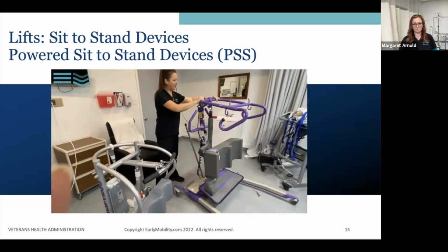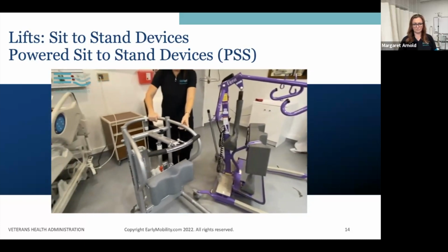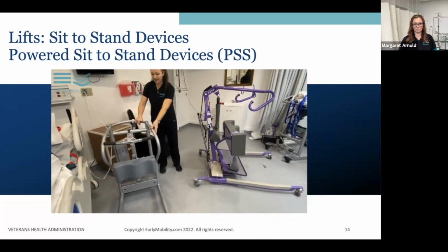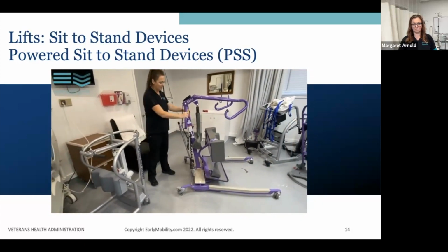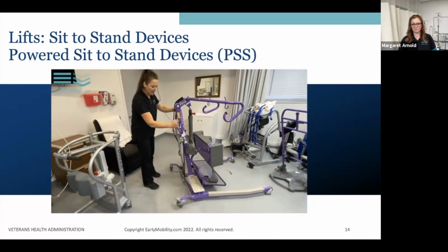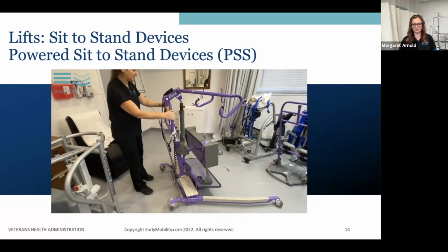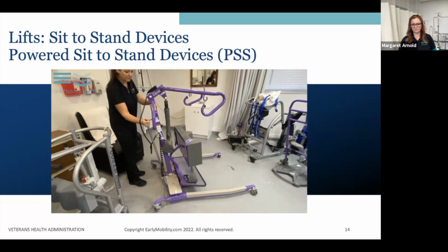The bariatric lift has a slightly different way of moving the feet in and out, and different manufacturers have accomplished this in different ways. The Vancare lift, you have a lever which pulls around and you see the feet going out and in. If we bring it back, the feet come in.